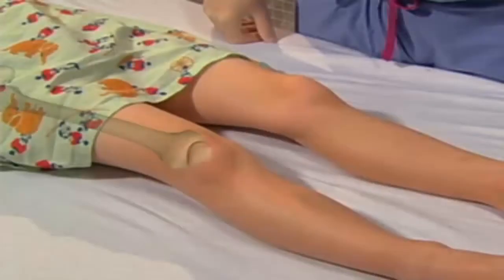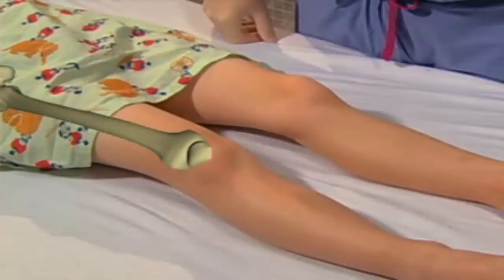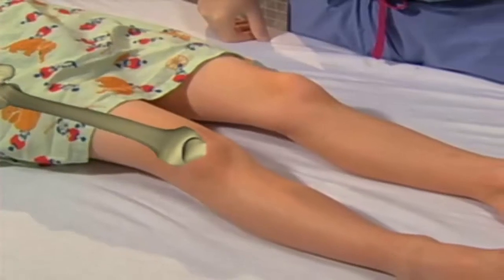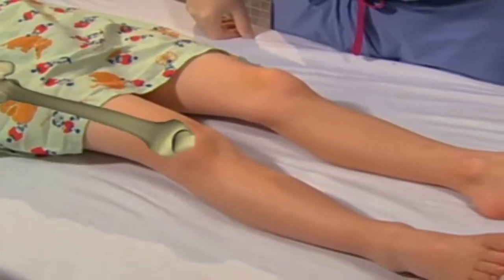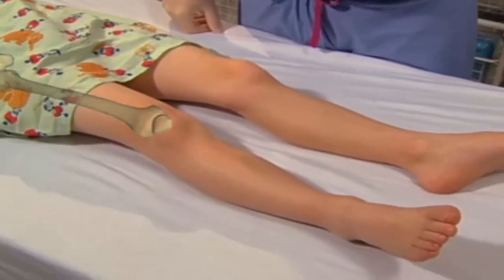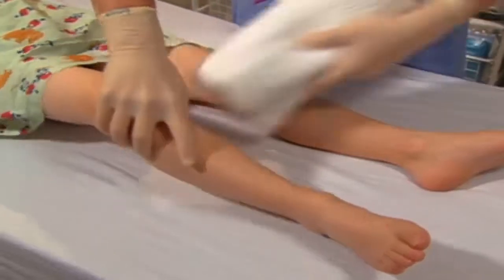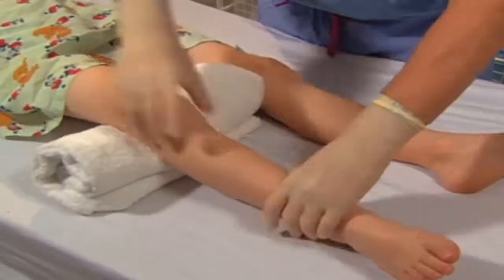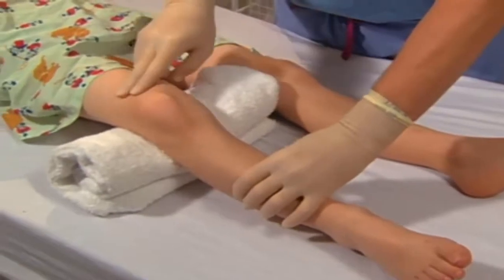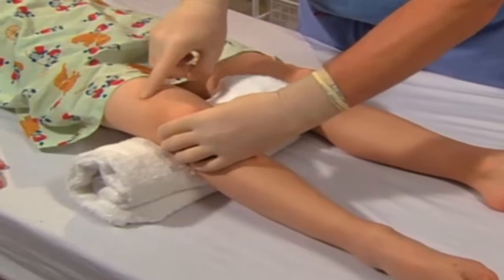The distal femur can be cannulated for intraosseous infusion, though abundant overlying soft tissue and muscle often make identification of bony landmarks challenging. Therefore, this site should be considered when the use of tibial and humeral sites is contraindicated. To relax the quadriceps, flex the hip and knee slightly with a towel roll. The distal femoral insertion site is in the midline, just one to three centimeters proximal to the palpable epicondyles of the distal femur.